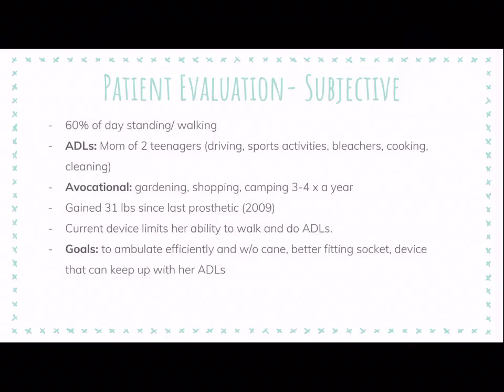It's buckling because of the decreased flexion resistance function of the knee, and it had been sent out to Ottobock for repairs, but they returned it saying that it should be replaced due to the wear and the malfunctioning of it, so they don't want to have any risk of falling or anything with that knee, so it should be replaced.